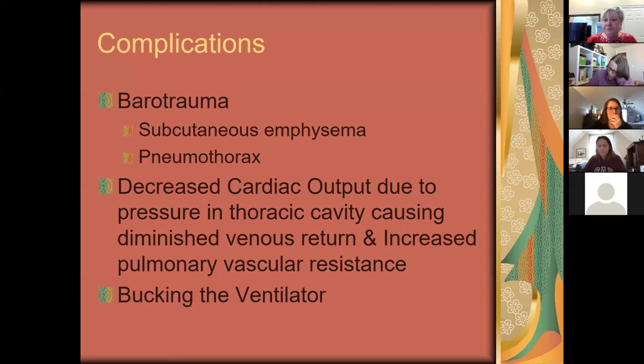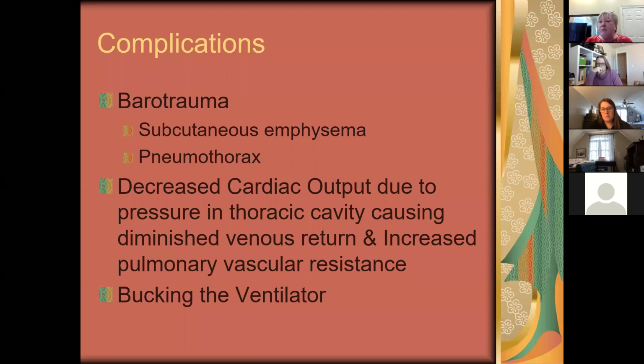Absolutely. So then would you decrease the PEEP level? Yeah, we would probably drop the PEEP down. Maybe we were doing the PEEP so that we didn't have to increase their FiO2 so much. I mean, why were they on the PEEP is the question.